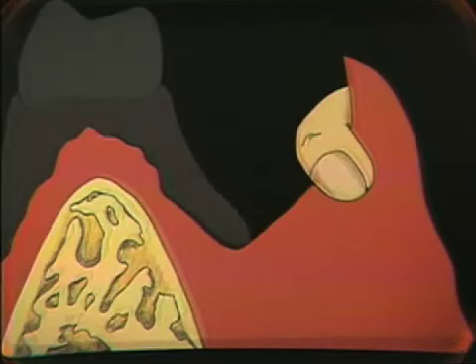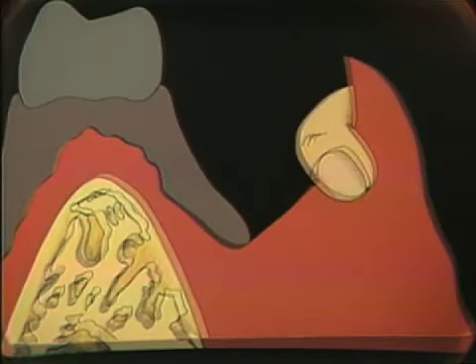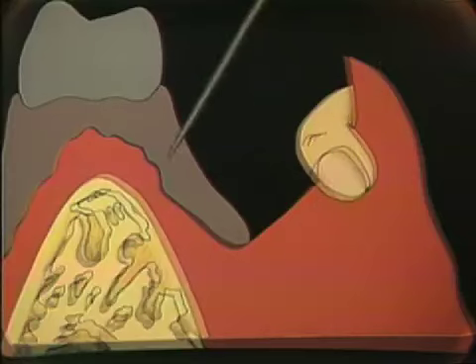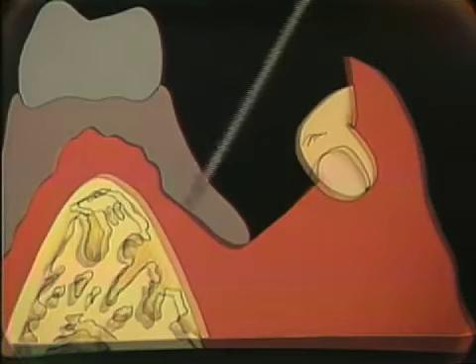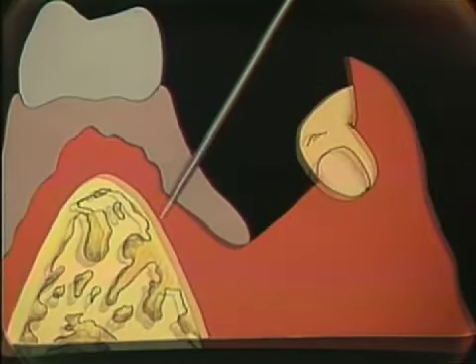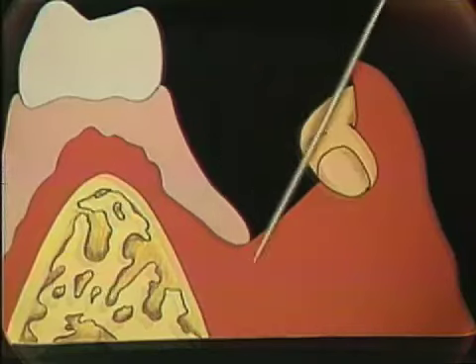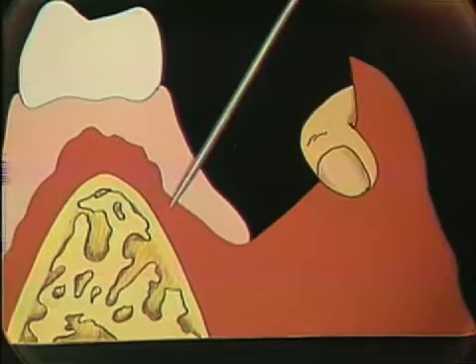If we take this distorted impression, we pour it up, and then we make a base to fit this distorted position, we can have a base that appears to fit this position quite accurately. If you notice in here, this base can be made to fit this distorted position. We distorted this ridge area, or the peripheral tissues, part of the way up the ridge.